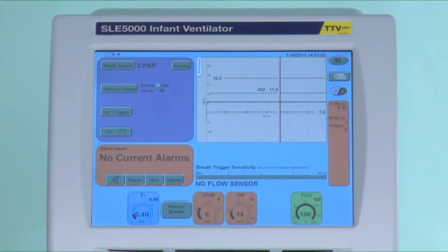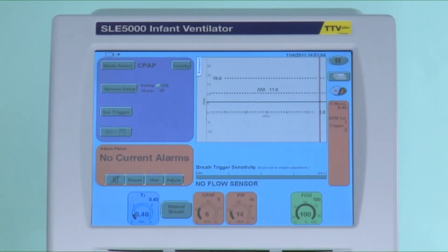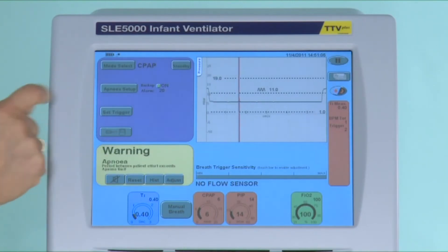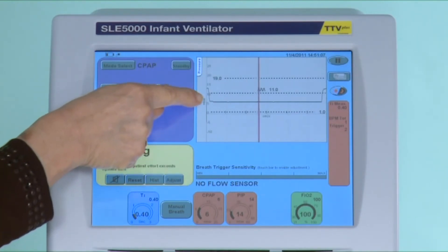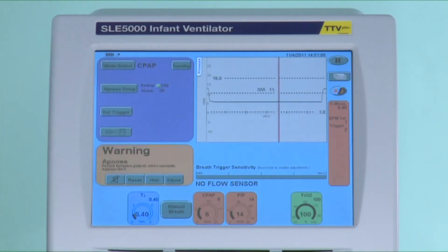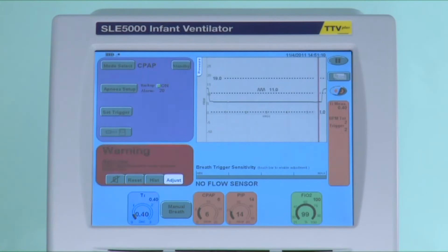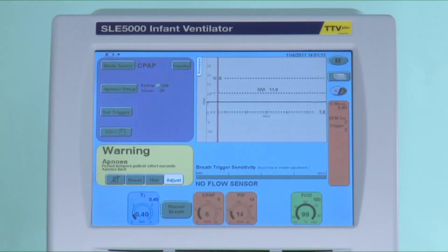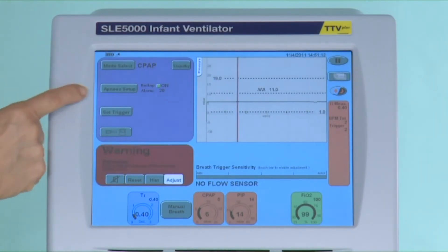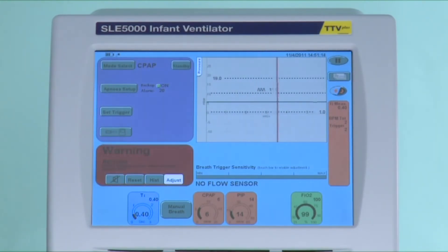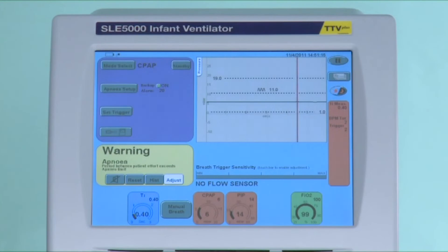If you watch the screen now you will see a backup breath being delivered. You can see a backup breath has been delivered, and this will continue every 20 seconds until the infant either re-breathes or somebody attends to him.